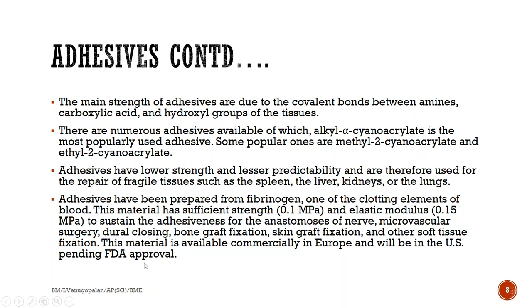If it's a big superficial cut in the thigh, or if the surgeon is trying to repair your quadriceps, then adhesives are probably a very bad idea because they do not have that much strength. The cords would never be as strong as they were previously, right?